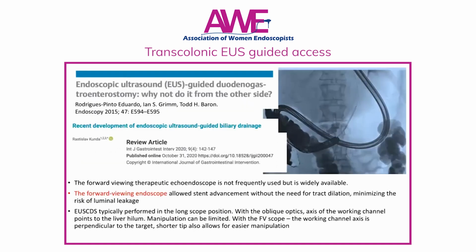And in this review article in 2020, they suggest that the forward viewing therapeutic echo endoscope is actually widely available, but it's not frequently used. And this forward viewing scope actually allows us to view the target area better.